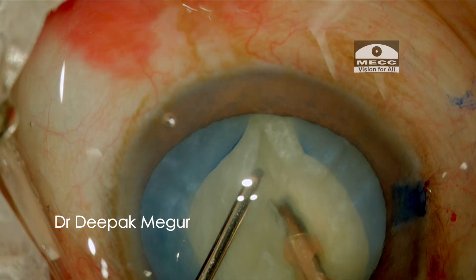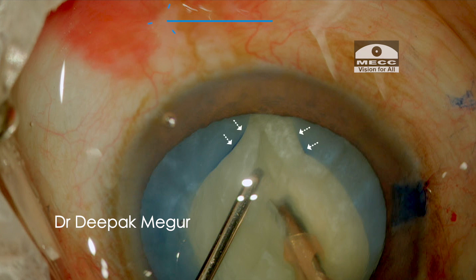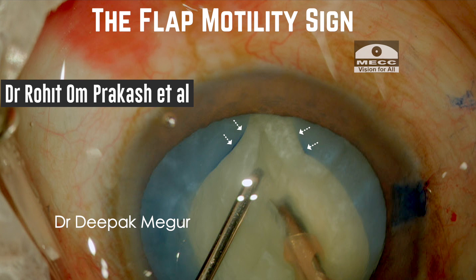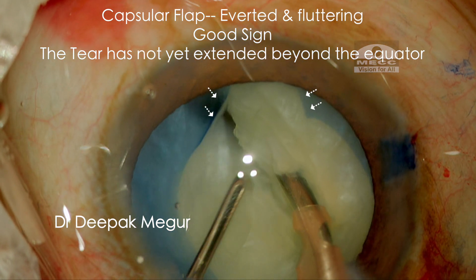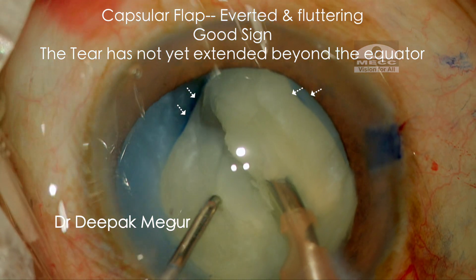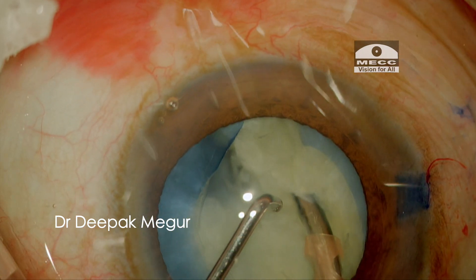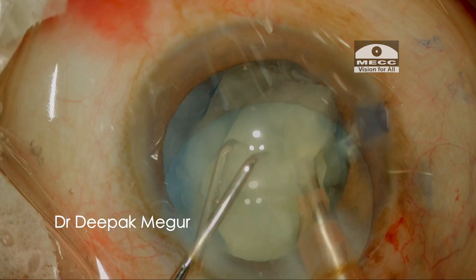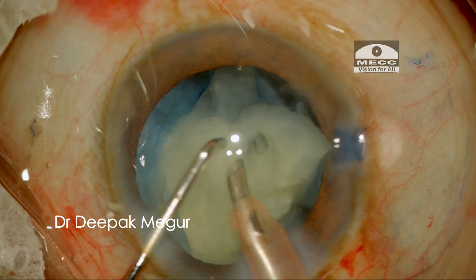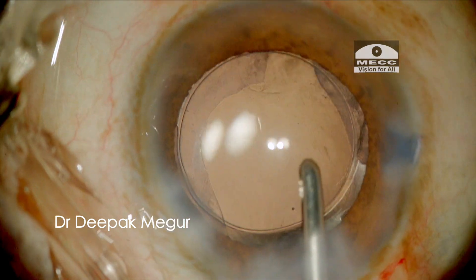Going back to the anterior capsular flap, let me describe the importance of keeping a close eye on this flap during the entire procedure. Dr. Rohit Omprakash from Amritsar, India, described this concept of the flap motility sign, which essentially is: as long as the intact anterior capsular flap is everted and fluttering, it indicates the anterior capsular tear has not extended beyond the equator. But if the tear extends beyond the equator and goes into the posterior capsule, then the flap will stop fluttering and get inverted, hinting that we are staring at a possible PC tear. So the message is, if we don't see the flap everted and fluttering, it should warrant us to convert to SICS or ECCE to prevent a nucleus drop.